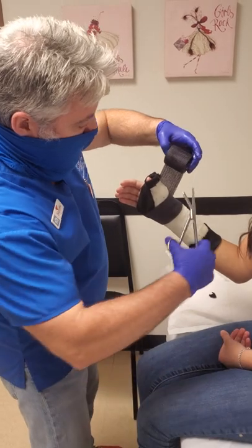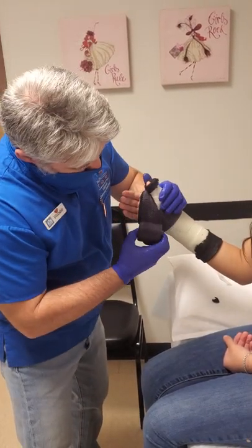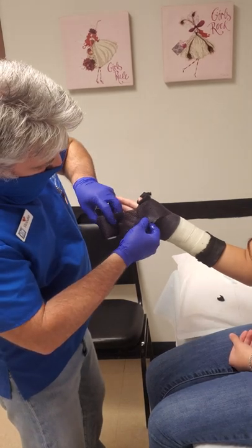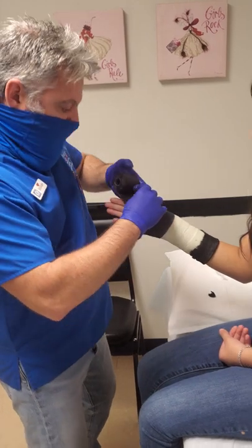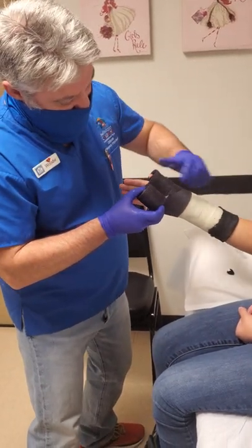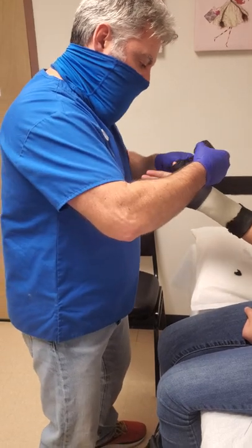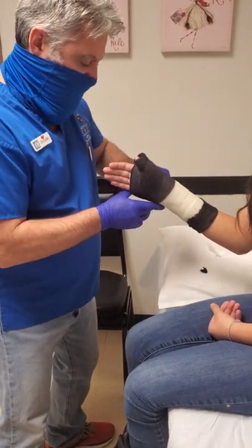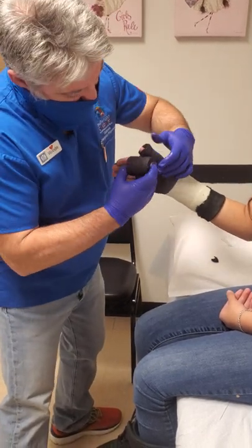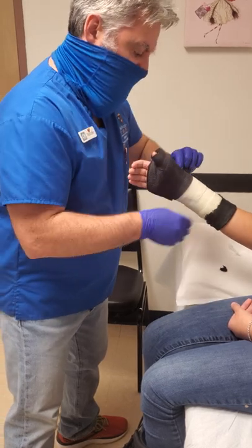We'll do the same exact thing with the second layer — the black layer. Everything's going to be repetitive. The second layer is for reinforcing and, of course, color of choice by the patient, so it's somewhat decorative. Come around the thumb and we'll do that little split to make it look nice and neat. You can notice that I folded over the stockinette at the edges so that you'll have nice soft bumpers on all the edges. Then just like we did with the white layer, we will come through one last time in between the thumb and the index finger just to lock everything down. This is almost the end of a thumb spica fiberglass cast.